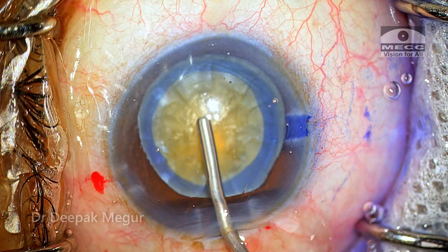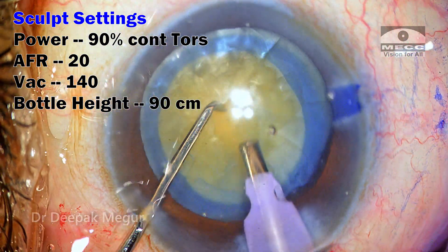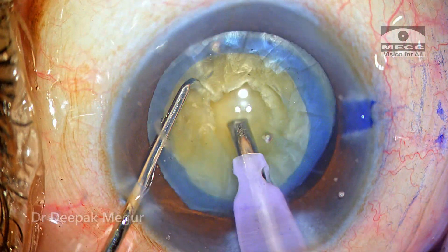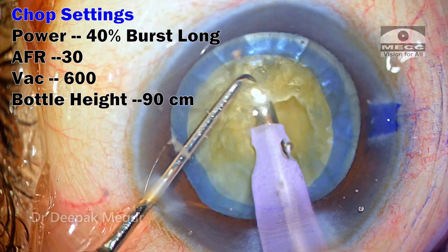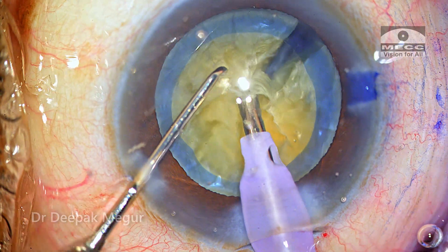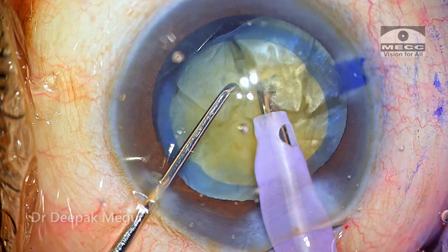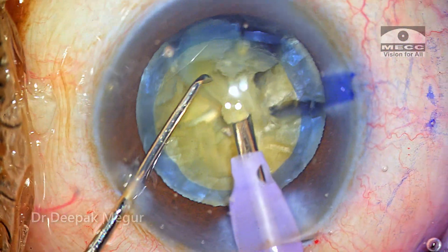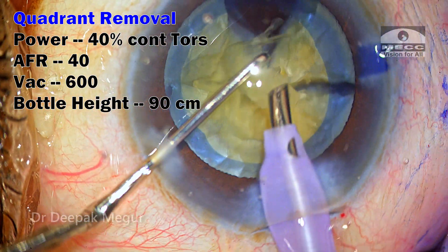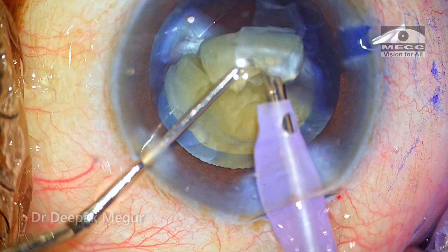No hydrodissection in this case; we go directly to nucleus management. As the nucleus appears slightly denser, my strategy is to make a few trenches and then bury the phaco tip into the core of the nucleus — that gives better grip — and then perform vertical chops. The first hemi-nucleus is divided into three smaller fragments and each is emulsified. Usually I prefer to chop the entire nucleus into six fragments, but in this case I chopped only one hemi-nucleus into three fragments first.